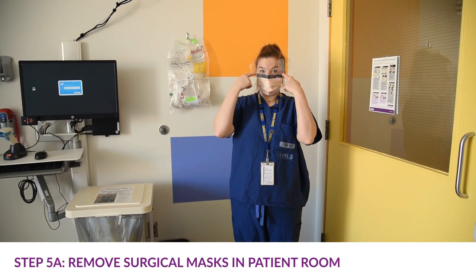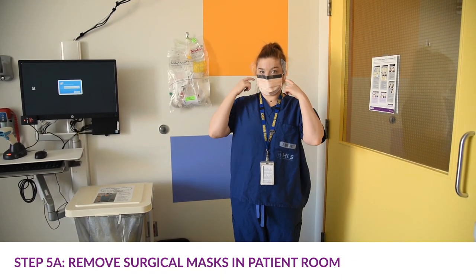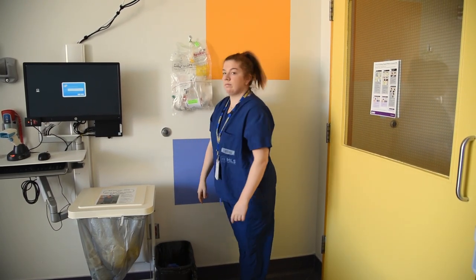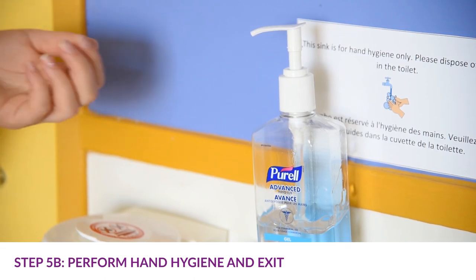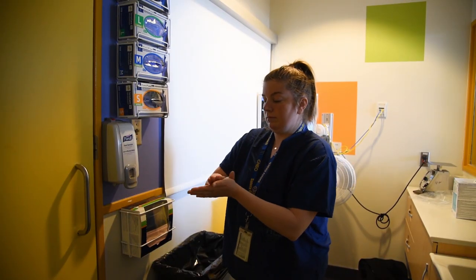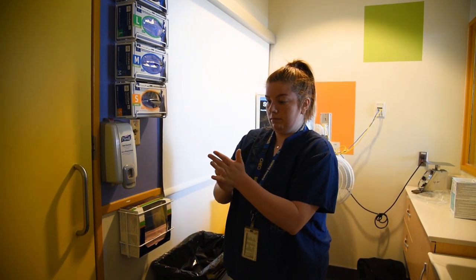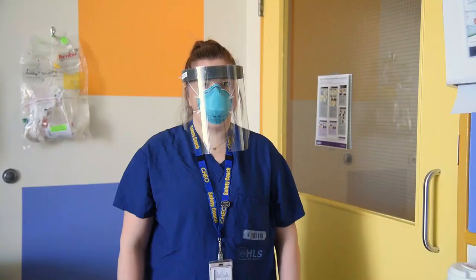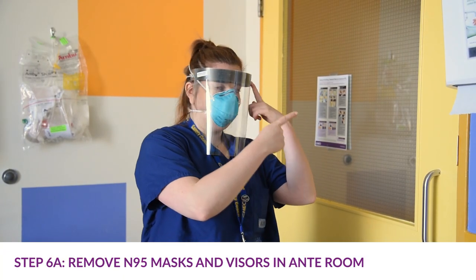If you're wearing a surgical mask, stay in the patient room while removing the mask. Lean over the garbage, unfasten the mask, and let it fall into the garbage can. Perform hand hygiene in the patient room and exit into the ante room. Perform hand hygiene a final time before exiting the ante room.